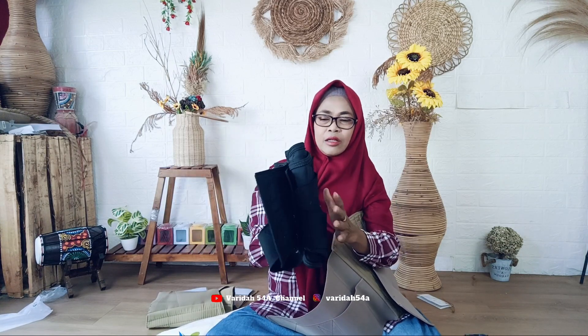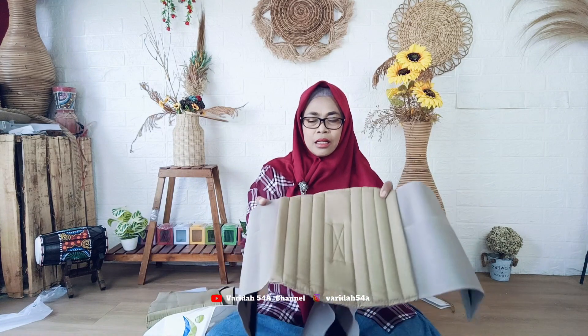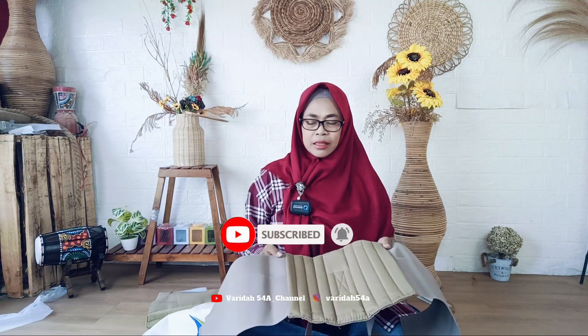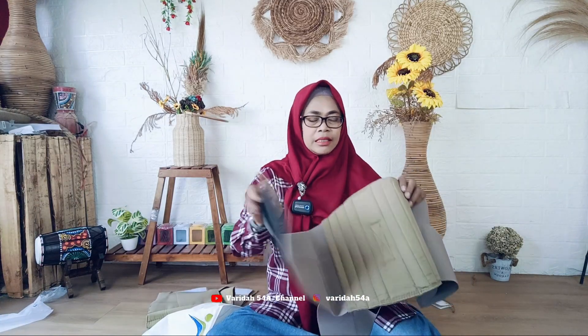Di video sebelumnya, saya juga pernah beli korset warna hitam dengan merk yang berbeda, sudah ada di video sebelumnya ya, silahkan dilihat. Korset yang lama itu sudah lama dipakai makanya sudah waktunya ganti. Jadi saya beli ini ukuran XL. Ini bermanfaat sekali, bisa menegakkan tubuh dan membantu meringankan sakit pada pinggang dan tulang belakang.